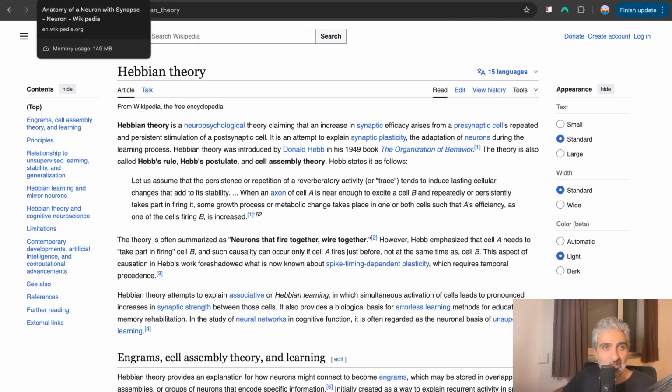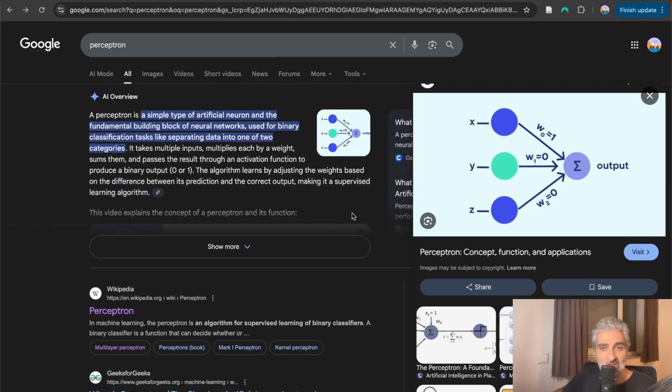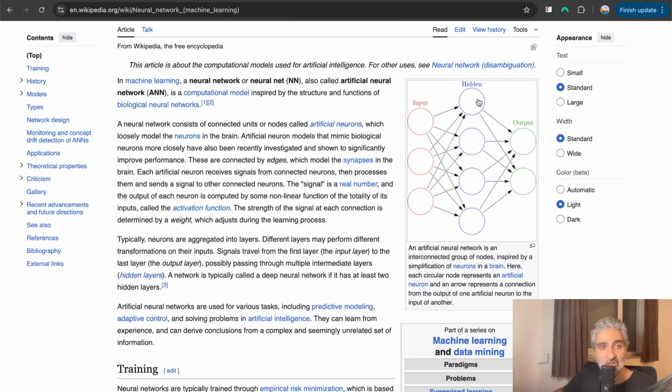This architecture, again, inspired the neural networks. So you have the perceptron here, which is a very basic single artificial neuron, and you have input and then some processing in the node and then an output. How does this learn? The very basic unit is a linear function where you have y equals x multiplied by w plus b, which is the bias. So the w is what gets learned in the neural network. If you stack more of those neurons together, you end up with a neural network. And this is the kind that we are training right now.